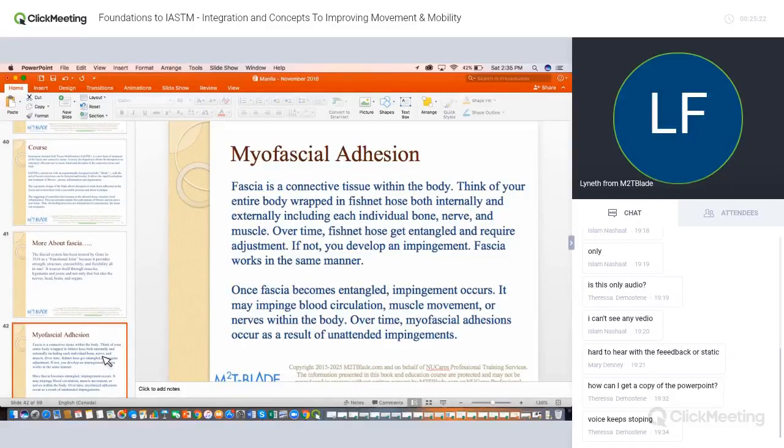So in our clinical offices, we use saran wrap. So think about all your muscle surrounded in this sticky wrap stuff. All our muscles slide and glide over top of one another. If we have any damage or friction over muscles, that sticky wrap can get stuck together, cause that impingement and cause that pain. Leading to that, if I have an impingement, I have a decrease in range of motion. We have an increase in pain.